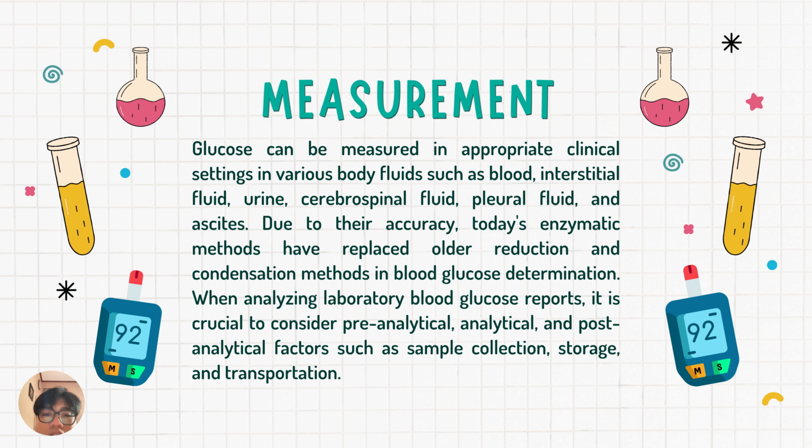Blood glucose measurement also can be used as a screening tool for diabetes mellitus. It is also essential to assess unwell patients, especially the young or old. That's all for me. Next slide.